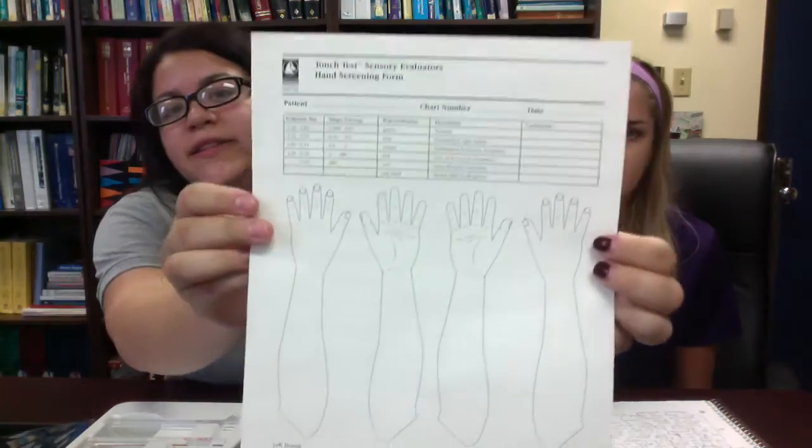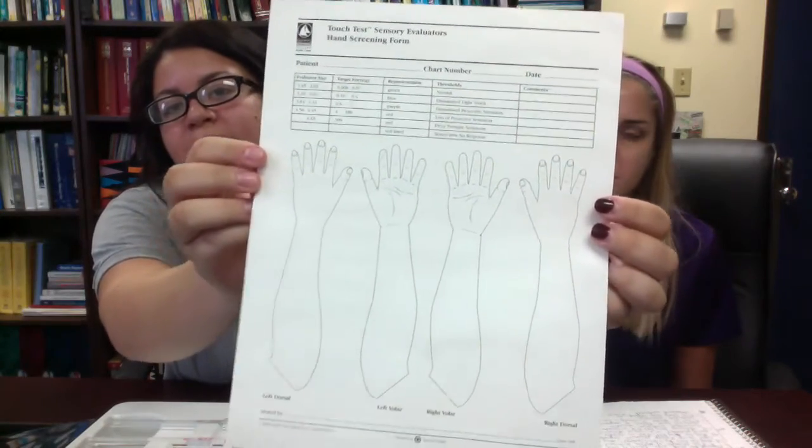So the therapist is going to record the responses on a grid. Usually it looks like this. It's probably going to come with the kit. And you're just going to start distally and move proximally when you're testing the areas of the hand, and you would just fill out your responses from the patient on this grid. And some therapists actually like to color code it so you can get a better map of the neuropathy.